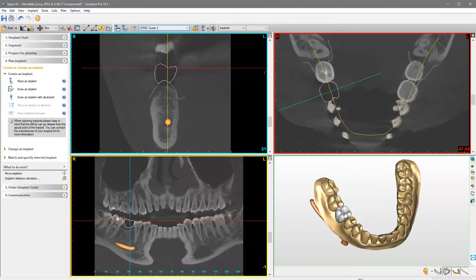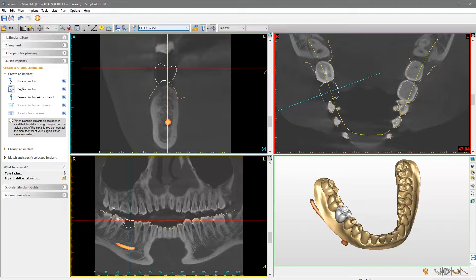Now, we select Draw an Implant in the task panel. We move the mouse cursor, which changed to the shape of a pen, to the cross-sectional view and with the tip of the pen, we indicate the location where you want to plan the implant shoulder.